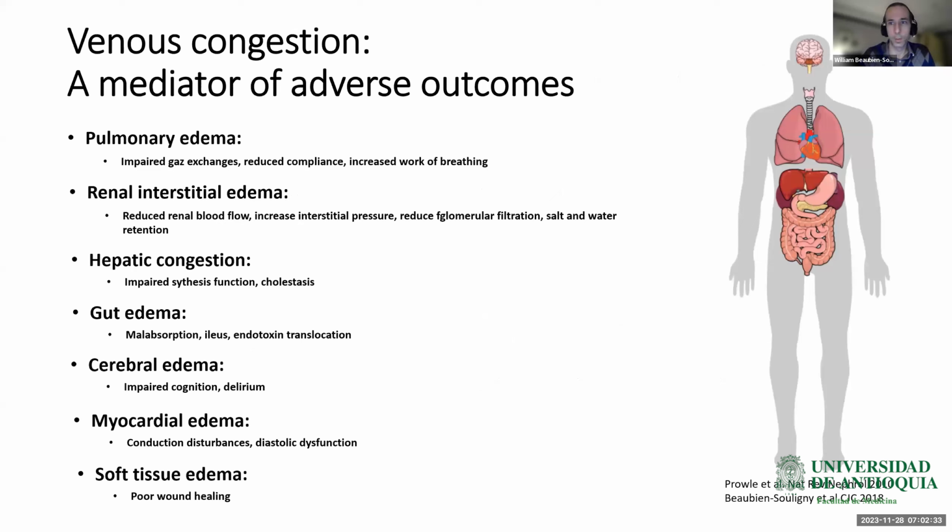And you can see also, very reminiscent of the previous curves that I showed you, when we consider mortality or morbidity related to pulmonary hypertension, the pattern of intrarenal venous flow was highly predictive of the complications in these patients.